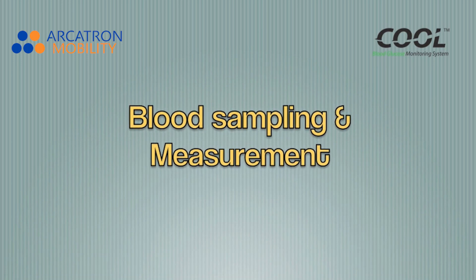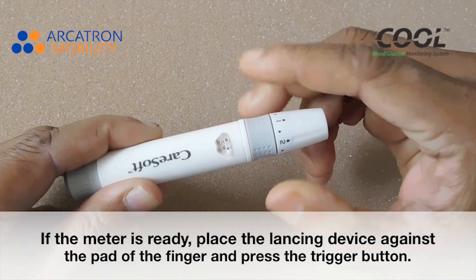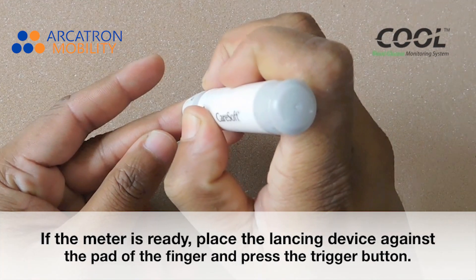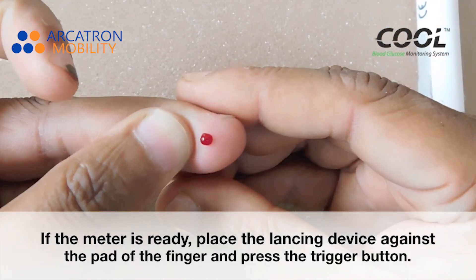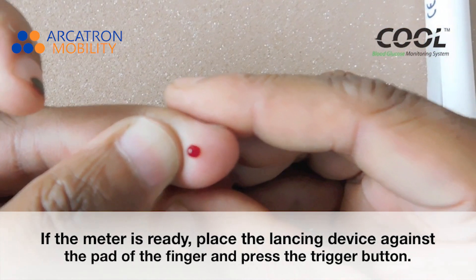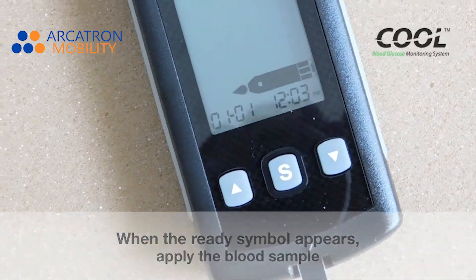Blood sampling and measurement. When the meter is ready, place the lancing device against the pad of the finger and press the trigger button. When the ready symbol appears, apply the blood sample.